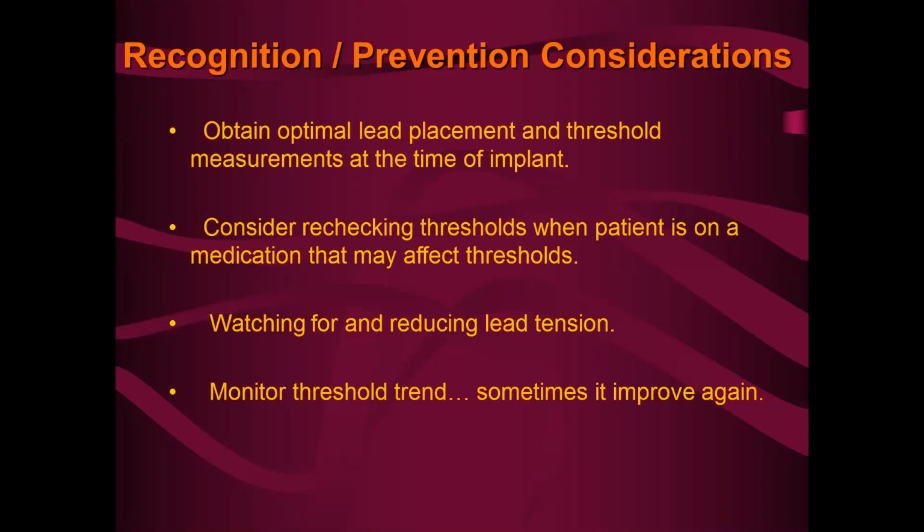And sometimes if you see threshold rises in a permanent pacemaker, it's still worthwhile to just continue to monitor it, as long as you can provide adequate safety margin to maintain capture. You want to just monitor it and not jump in to say, oh, the threshold increased, we'll have to replace the wire. So we don't do that.